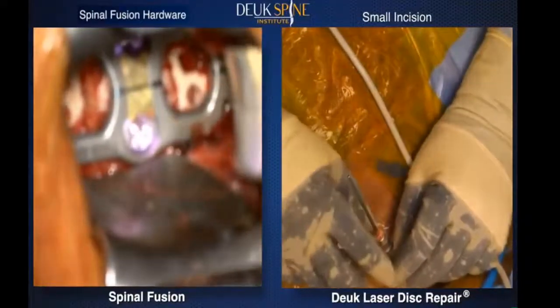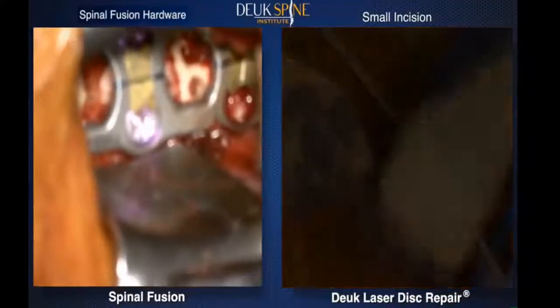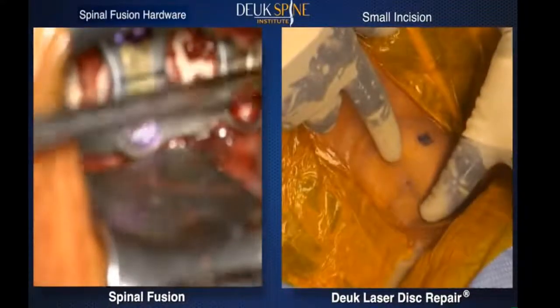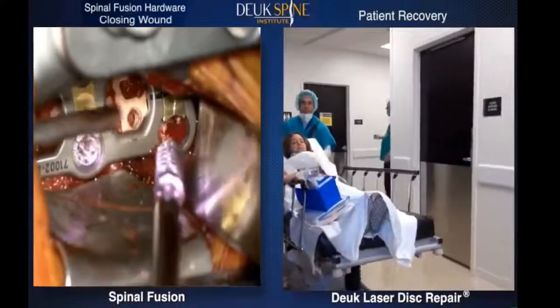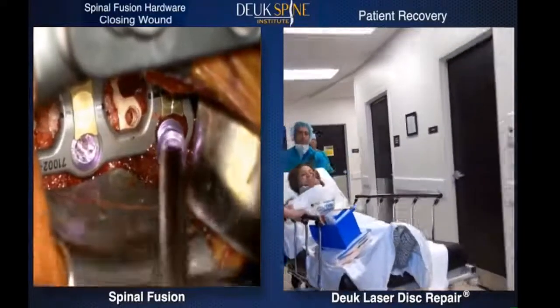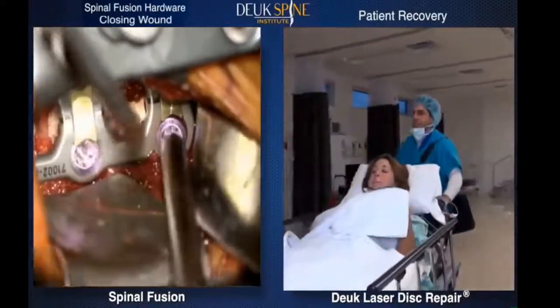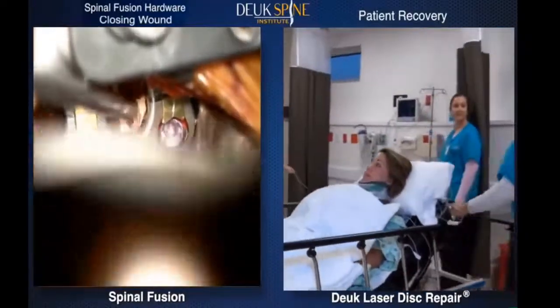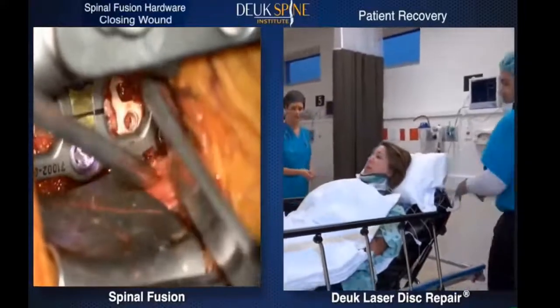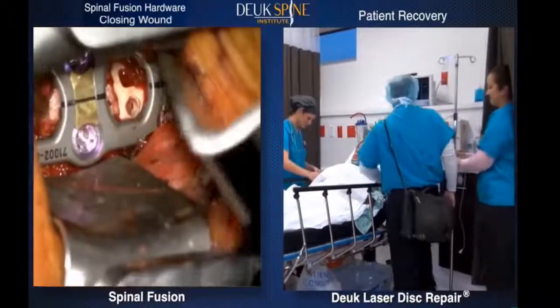Once the laser has removed the painful part of the annular tear, the endoscope and tubular retractor are removed, leaving less than a half inch incision in the skin, which is closed with a single stitch, Steri-strips, and a Band-Aid. Total time for the Deuk laser disc repair surgery, approximately 1 hour. The fusion, however, is still underway. Holes in the spine must be tapped in preparation for the large screws that anchor the fusion hardware. The Deuk laser disc repair patient is in recovery usually 45 to 60 minutes before release to go home.